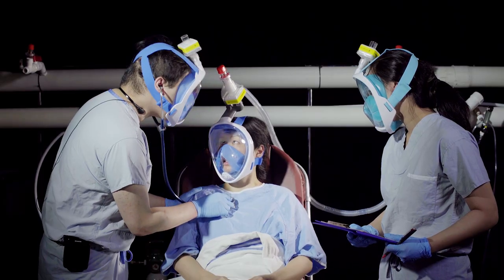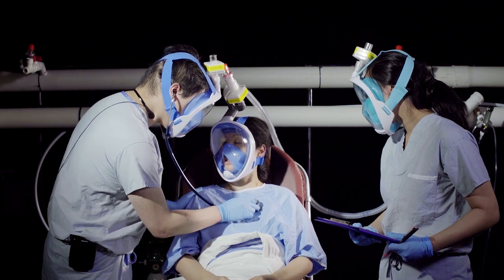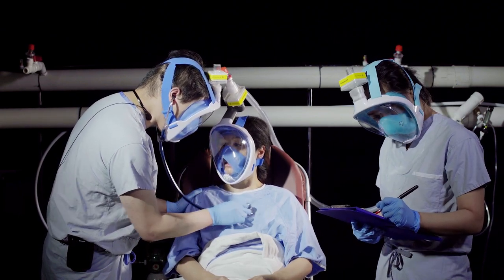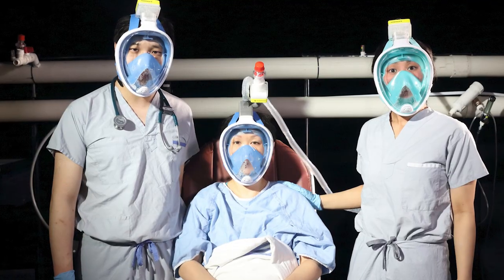We've also adapted a snorkel mask for use by patients requiring non-invasive positive pressure ventilation. This design first came out in Italy and was used in hospitals across Europe. The adapter has an inspiratory and expiratory arm that can be connected to a respiratory flow supply and a HEPA filter respectively. Air will be given to the patient through the inspiratory arm, and all exhaled air will be filtered by the HEPA filter before being released into the environment.